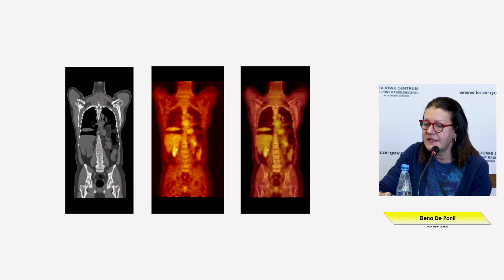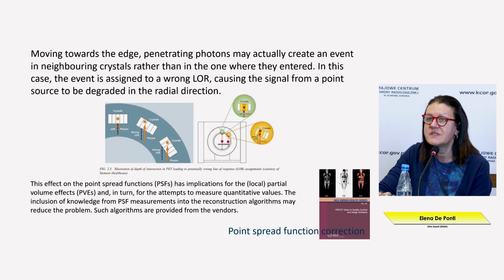This is an example of a high frequency artifact from the moving of the liver that makes the map incorrect, and we see the same artifact also in the PET reconstructed images.